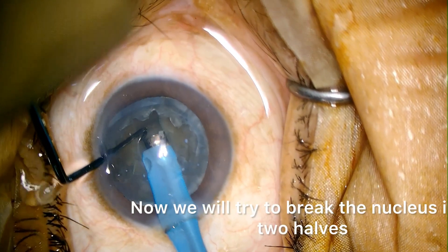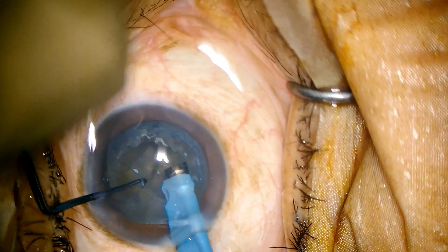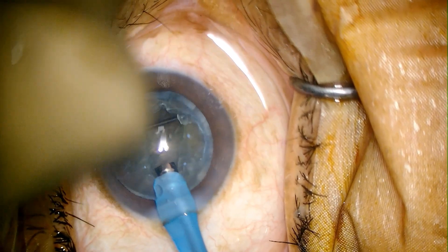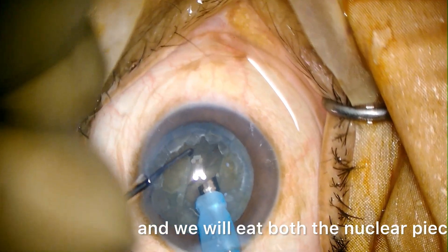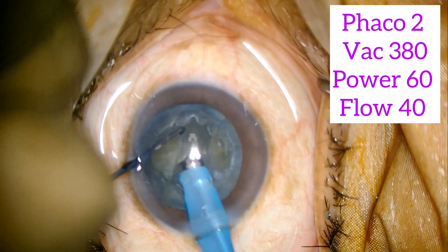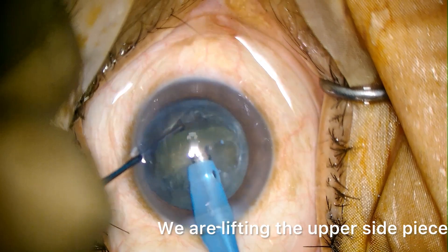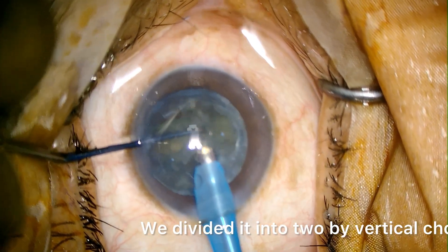Now we will try to break the nucleus into two halves. We have got the break. Now we will shift to phaco 2 and we will eat both the nuclear pieces by dividing further. We are lifting the upper side piece. The whole piece came out. We divided it into two — phaco 2 by vertical chop.